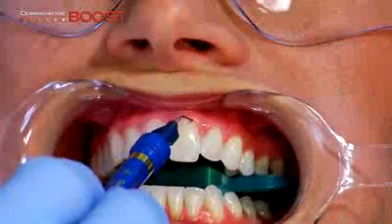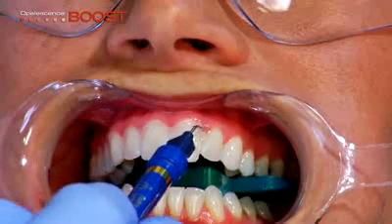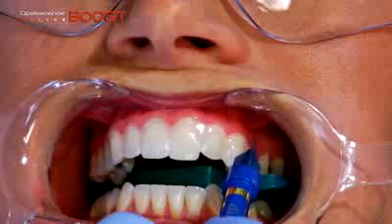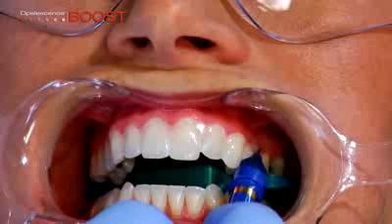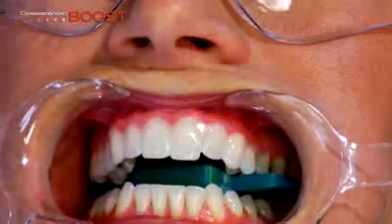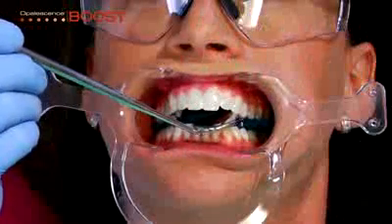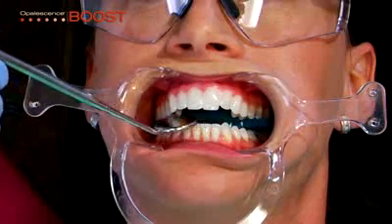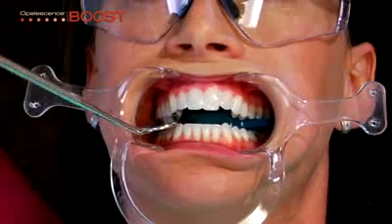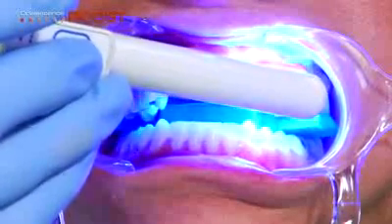Apply a 1 to 2 millimeter wide barrier of Opaldam on the gingiva. Seal the inner proximal spaces. Overlap the resin approximately 0.5 millimeters onto dry enamel to seal. Extend the resin 1 tooth beyond the last tooth to be bleached. Visually check that all gingival tissues at the resin margin are covered and a seal is established. Light cure the resin approximately 10 seconds per tooth.